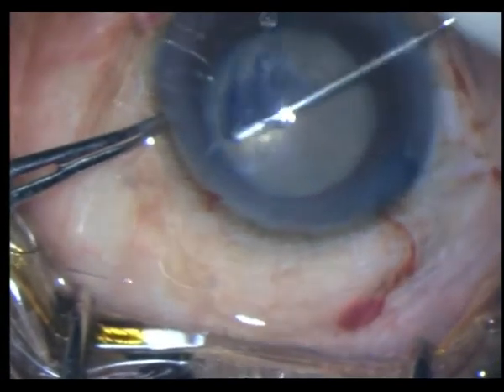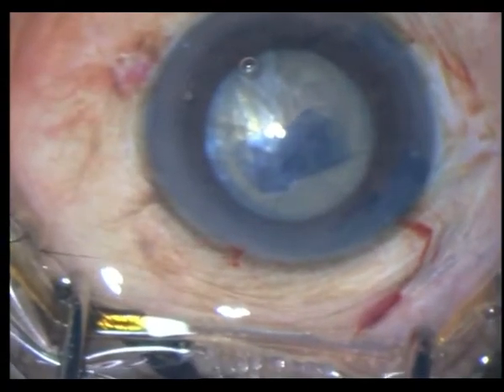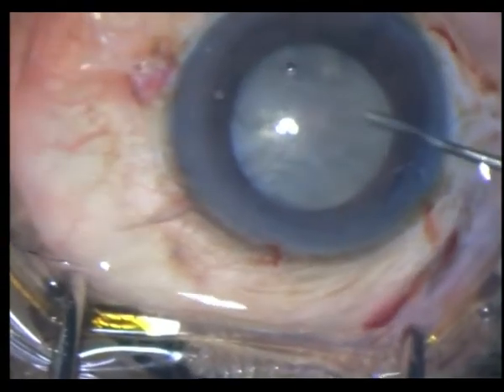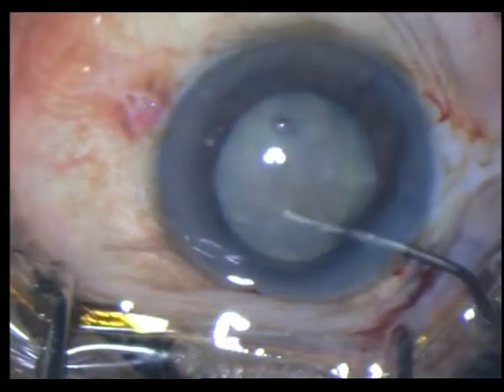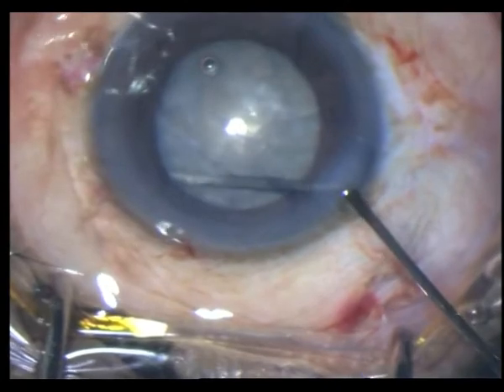The zonules look pretty strong although there is PXE, and then I perform my hydrodissection, making sure that the nucleus has become pretty mobile.